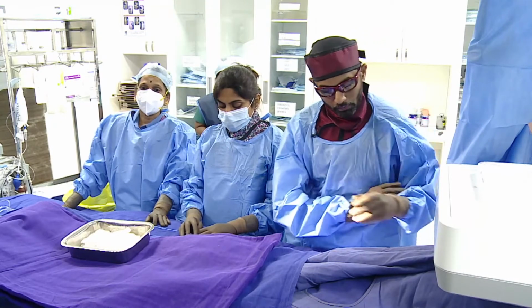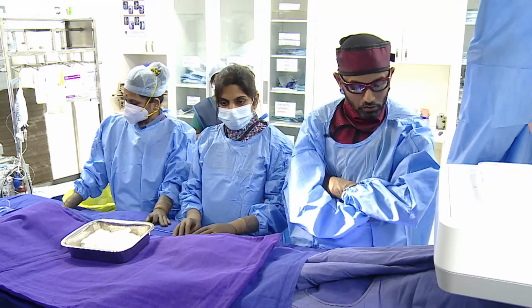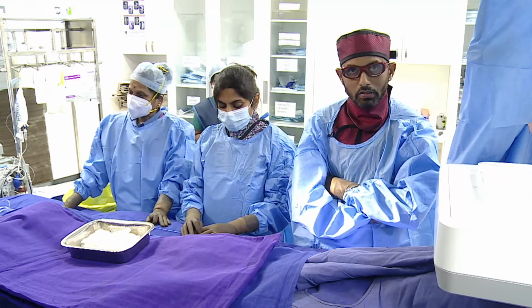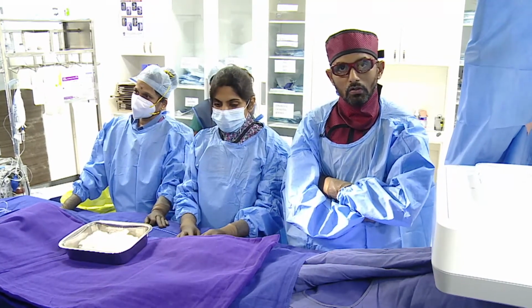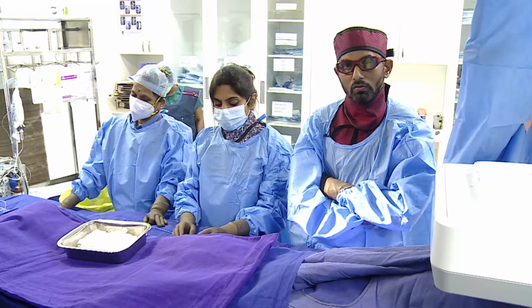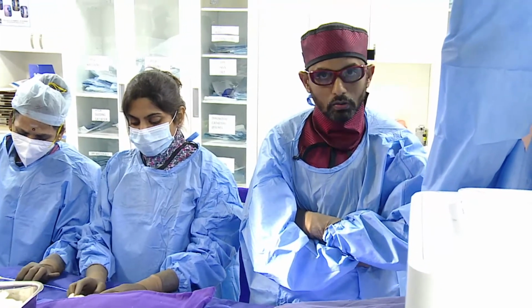So what we are planning to do is a transradial rotablation. So we started with the 7 French slender sheath in the right radial. Essentially the outer diameter of the 7 French slender sheath is equivalent to the standard 6 French sheath. So the advantage is you can use a 7 French guiding catheter through the radial artery without needing to expand the artery more than what we would with the 6 French sheath. So that's a special sheath.